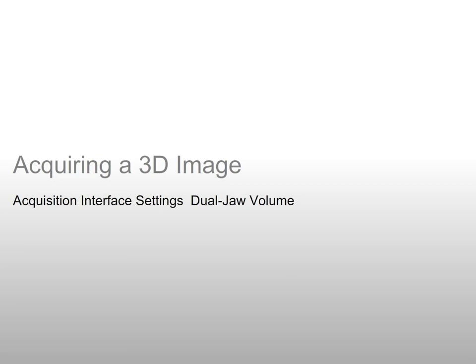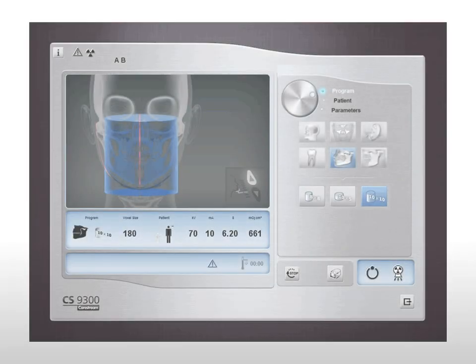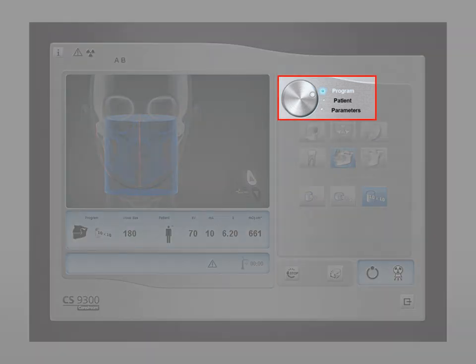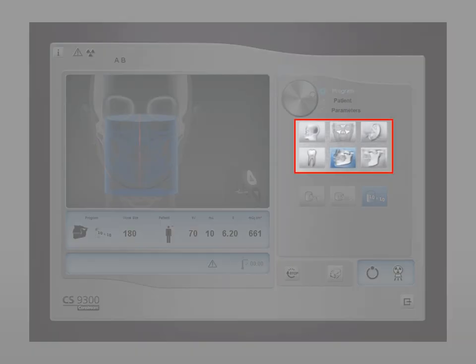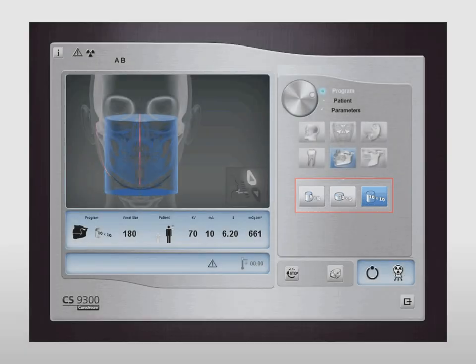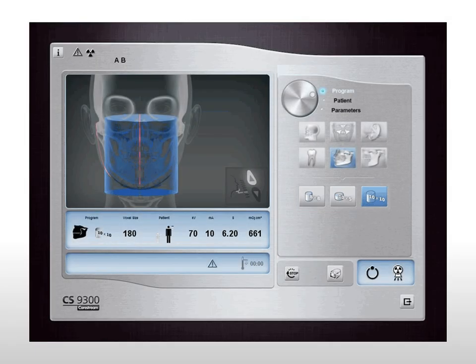Acquiring a 3D image: acquisition interface settings for a dual jaw volume. Use the program button to select examination options. In the 3D acquisition window, click the program button to access the program pane, select the desired radiological exam, and select the image size and quality. See the CS9300 user's guide for an explanation of all radiological exam options. In this example, we will demonstrate acquisition of a dual jaw volume.